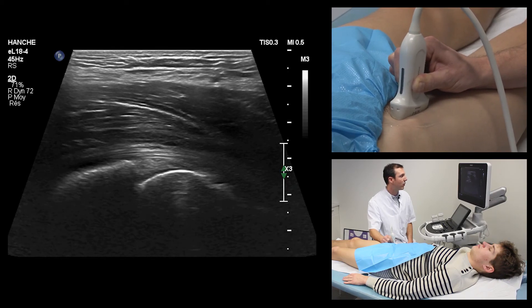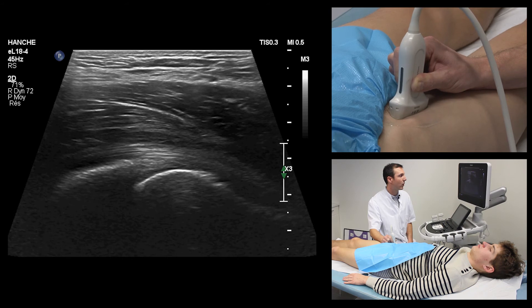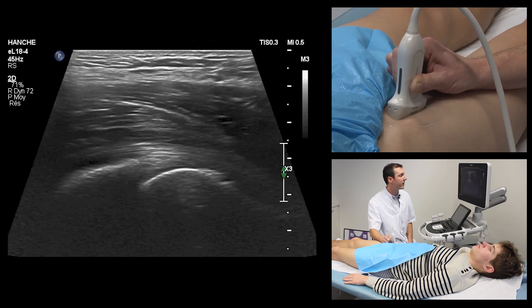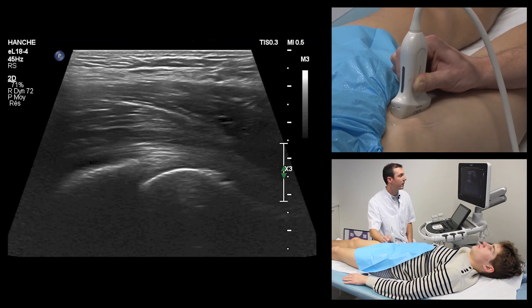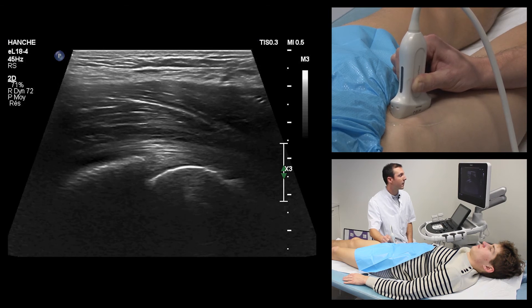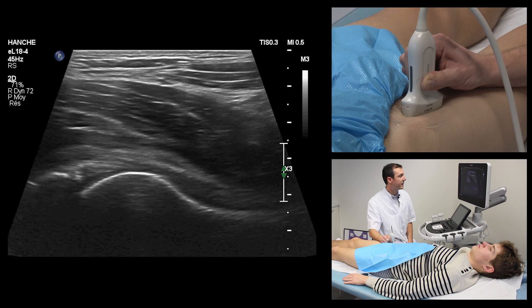This sagittal view also allows exploration of the labrum, the bony cortical shape of the femoral head, and looking for liquid in the anterior articular recess related to arthropathy.